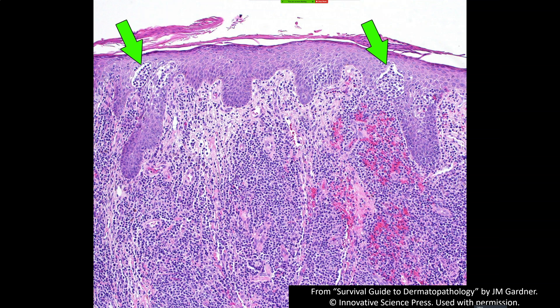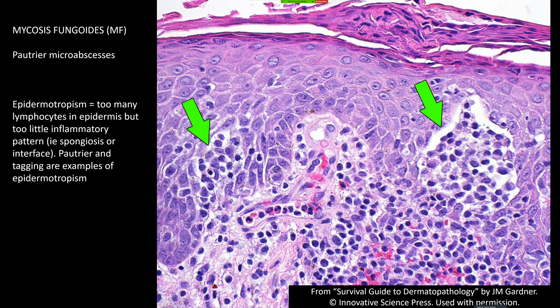Here's a more exuberant example — probably plaque stage or even tumor stage mycosis fungoides. In addition to the dense infiltrate in the dermis, look up here: we have clusters of atypical lymphocytes forming little pockets in the epidermis — those are the classic Pautrier micro-abscesses. You don't always see those in MF. Interestingly, if you ignore those, there's actually not much tagging in this case. Each case is a little different — sometimes tagging, sometimes Pautrier abscesses, sometimes both. If a patient's been applying steroids or had UV exposure, you can lose all epidermotropism, making cases very difficult.